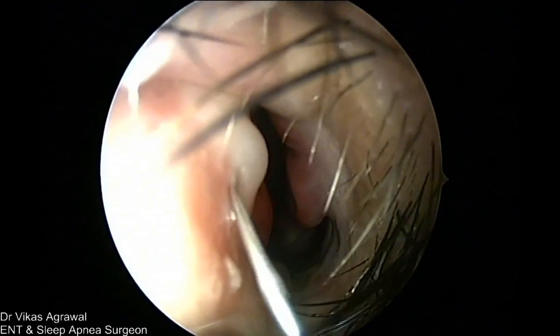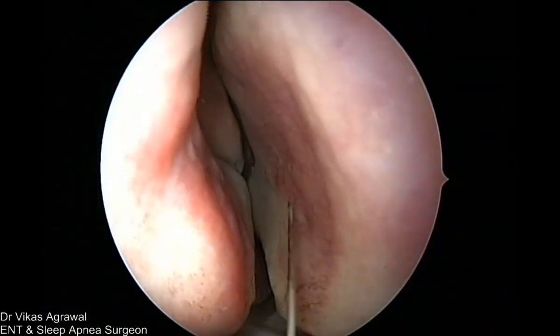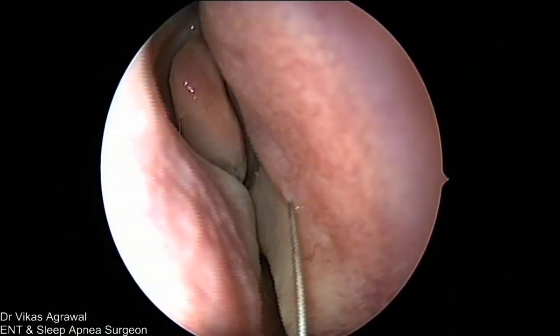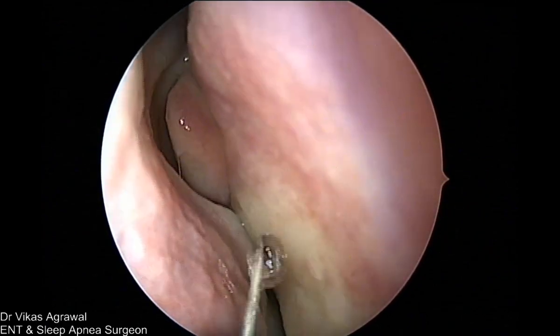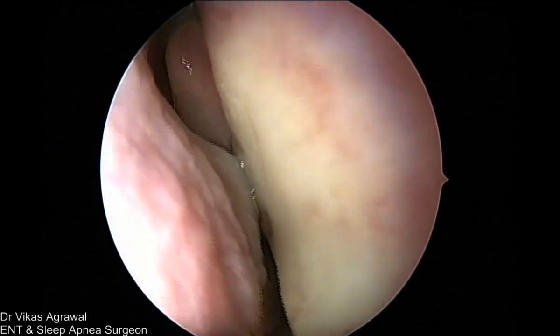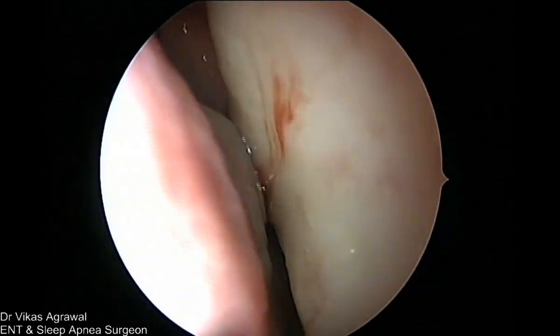And the anteriormost part. I'll infiltrate on the other side. There is hardly anything in the sinuses in this patient, but we see that the right side is completely blocked. So we'll start off with the septoplasty.